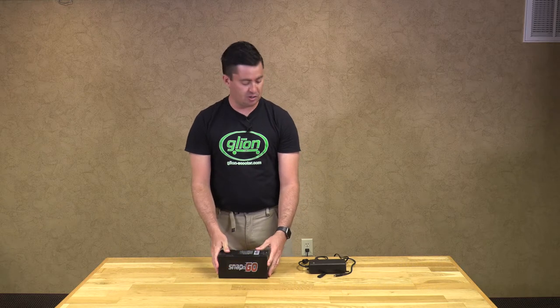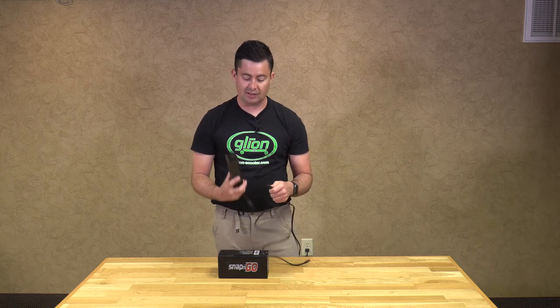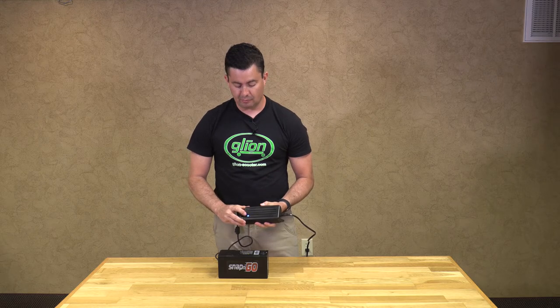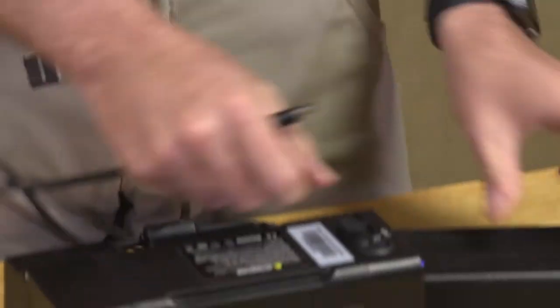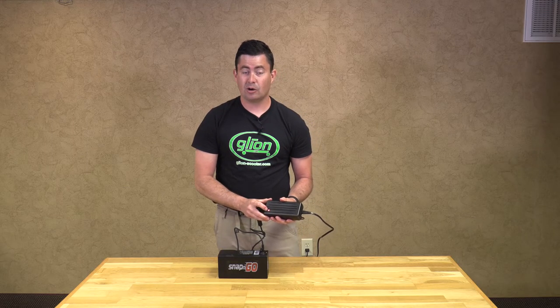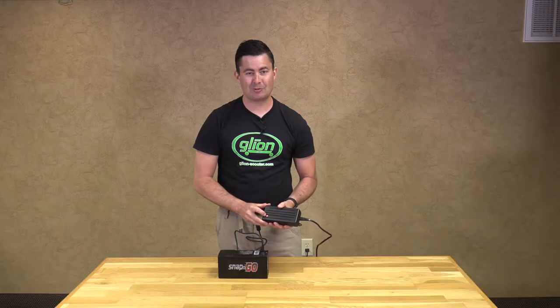Now I am going to show you how to charge your battery. You will take your included charging cord, which goes into the wall jack, then plug in your charger. The blue indicator light will turn on — blue means you have power to the charger. Then raise the rubber cover and plug it in. When it turns red, you are charging. When it turns green, you are fully charged and ready to go.